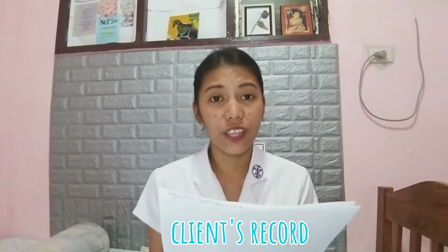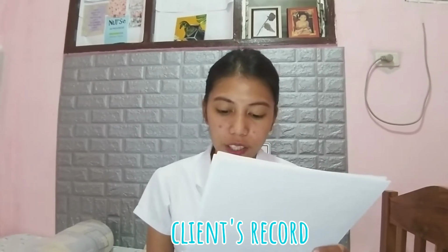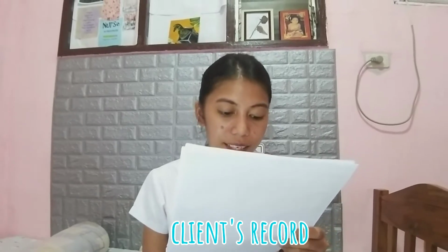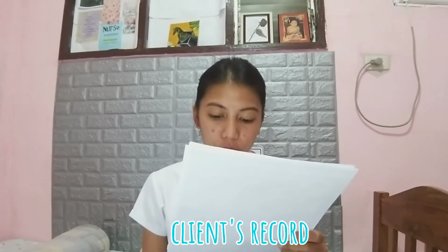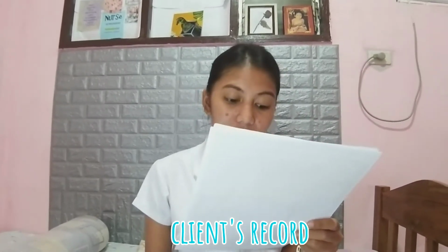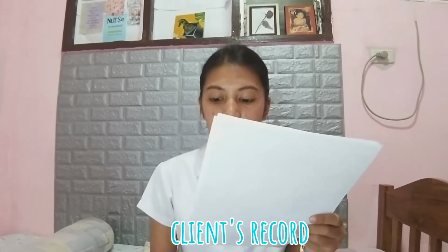So based on the doctor's order, on August 16, 2021, Monday at 9:30 a.m., Dr. Takdoro has ordered O2 inhalation at 2 liters per minute with 26% oxygen concentration via nasal cannula with continuous duration. Given that our patient has difficulty of breathing, the nasal cannula is more convenient and comfortable than a face mask, brings less anxiety, allows the client to eat and talk, and mouth breathing does not affect the concentration of the delivered oxygen.